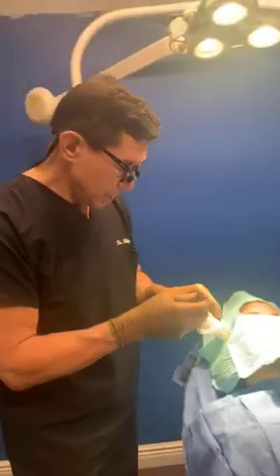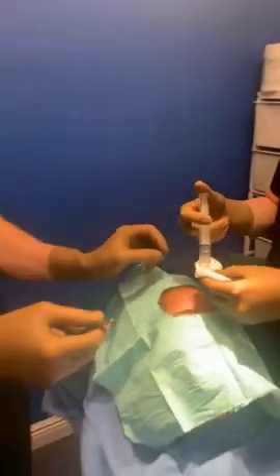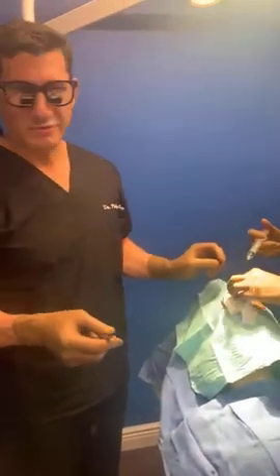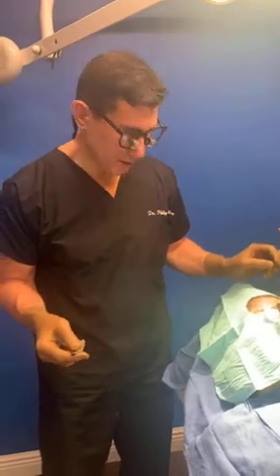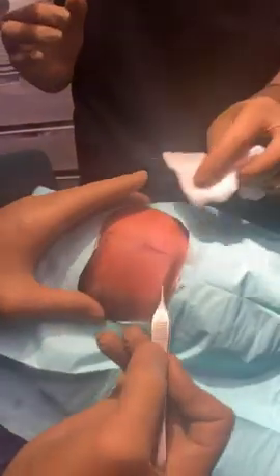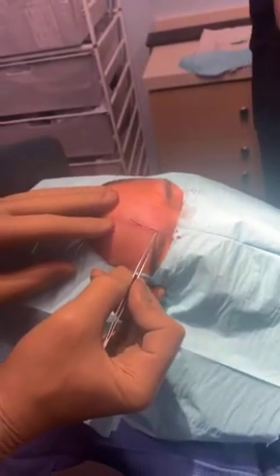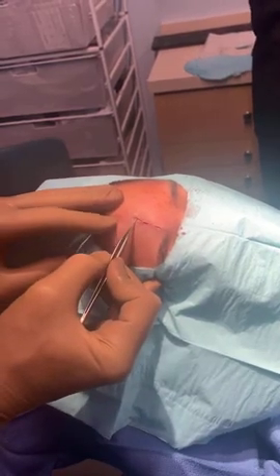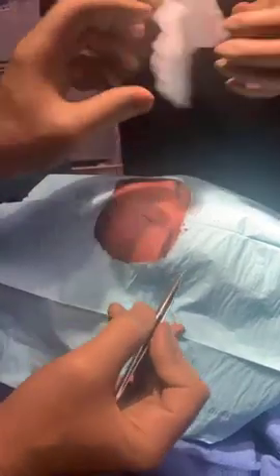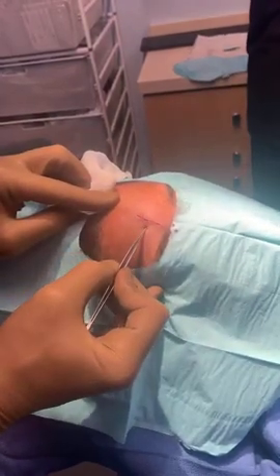Now I haven't put the final sutures in, but for our Instagram followers and friends, if you want to come over here just a bit, hold on just a second. There's not really that much red stuff there. If you come on over, okay, she originally, and I can show you a picture of this later, had a scar that went from here to here. Dab, please, 4x4. From here to here, and it was around that wide.